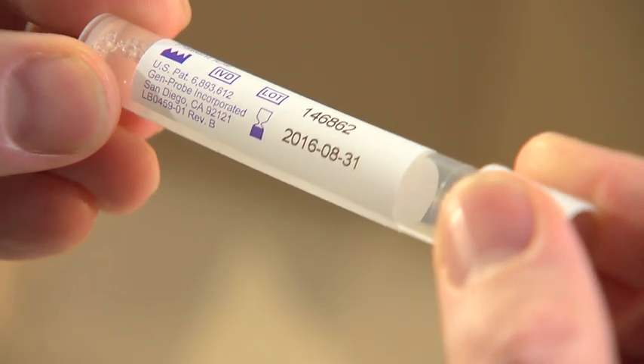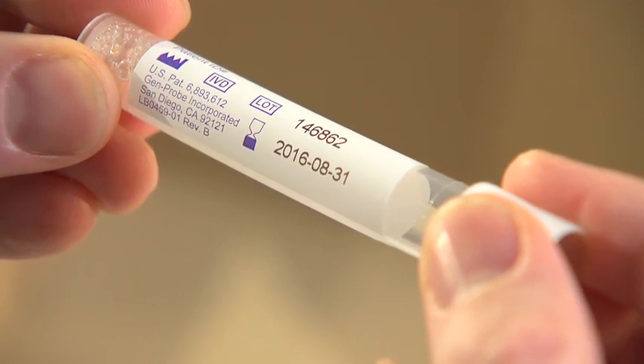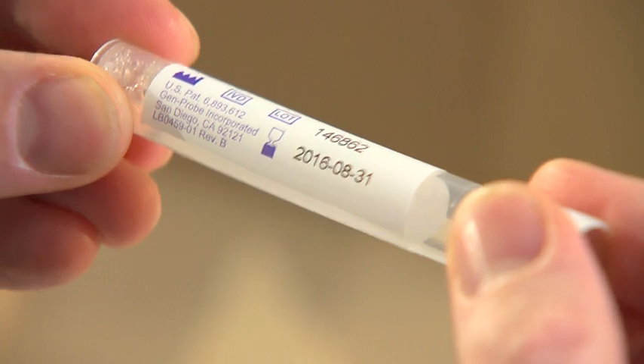Please check all the sample tubes in your kit for a use by date. You must collect your samples before the earliest date found on any of the tubes for us to be able to test them. If you are unable to collect your samples before this date, please request a new kit.